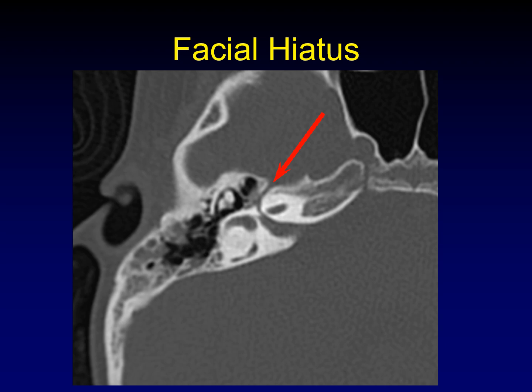This is the facial hiatus. Just to orient you, here is the labyrinthine segment of the facial nerve — you don't want to confuse that with a fracture either. This is the tympanic segment of the facial nerve, and that makes this the geniculate ganglion. Sometimes the geniculate ganglion sits all the way along the anterior aspect of the petrous apex, and sometimes it's a little bit tucked in, and so you need a canal for the greater superficial petrosal nerve to extend from the geniculate ganglion out into the middle cranial fossa. That canal is the facial hiatus — it carries the greater superficial petrosal nerve when such a canal is necessary.